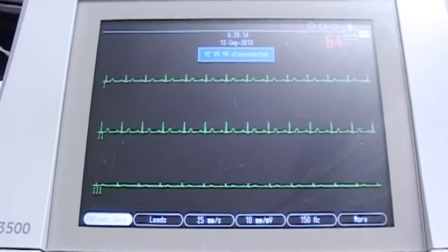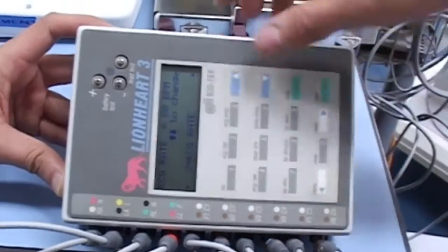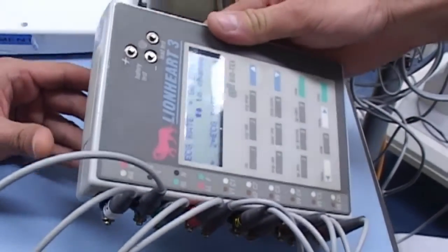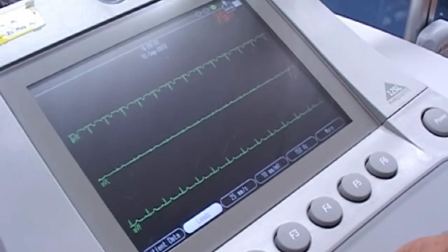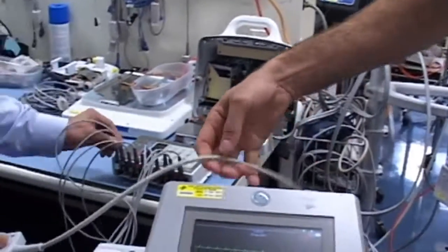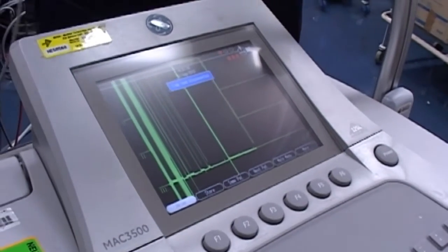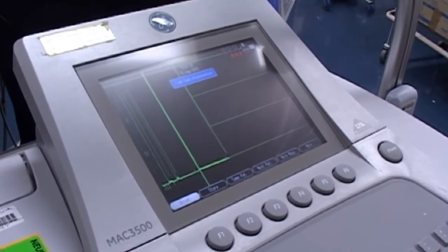There we go. There is a definite line between what's a medical device and what's not a medical device. At the end of the day, we have to make a clear understanding that anything that's connected to a patient is a medical device. A medical device has to meet a certain criteria, has to be tested at a certain interval under any ISO standard, so it can't be treated as just your standard computer.